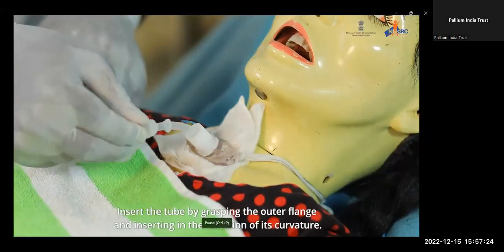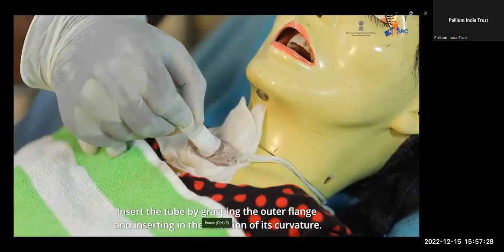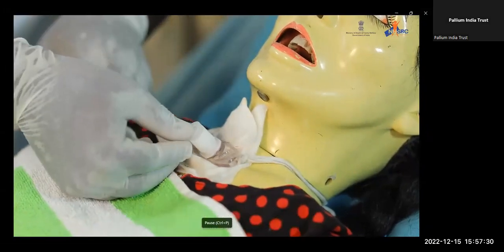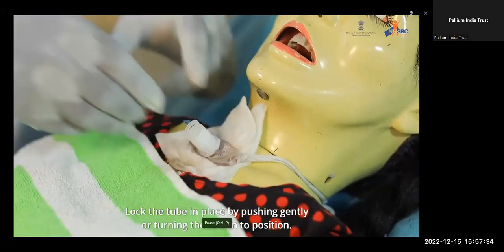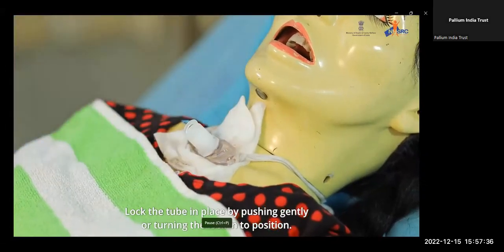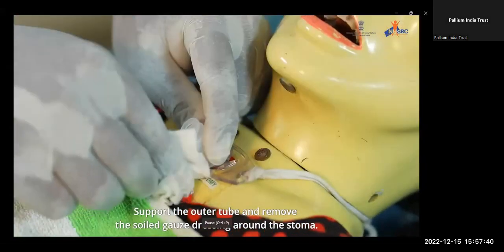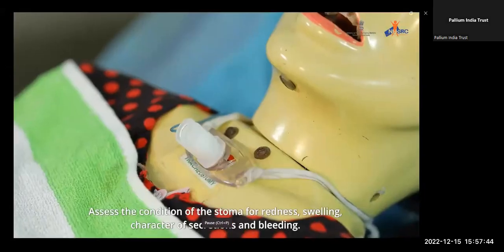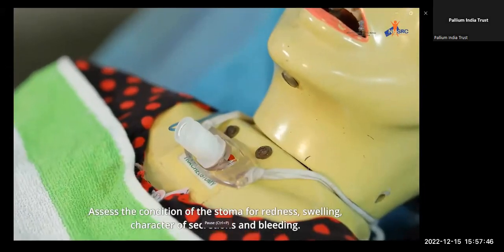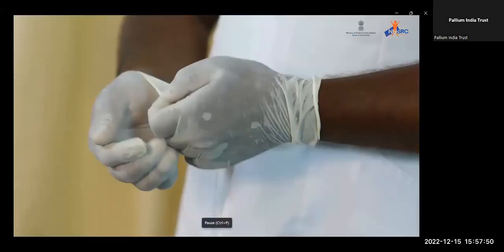Insert the tube by grasping the outer flange and inserting in the direction of its curvature. Lock the tube in place by pushing gently or turning the lock into position. Support the outer tube and remove the soiled gauze dressing around the stoma. Assess the condition of the stoma for redness, swelling, character of secretions, and bleeding.